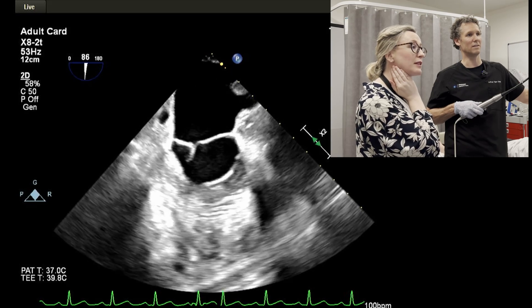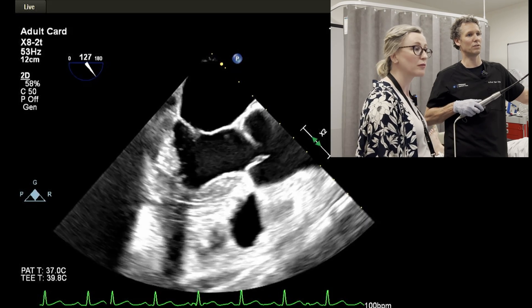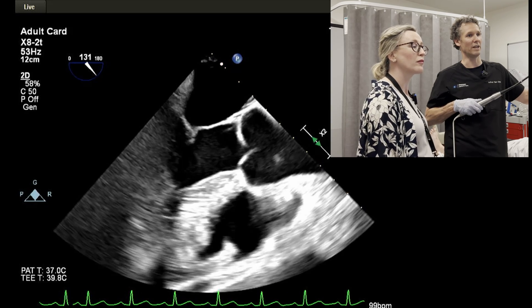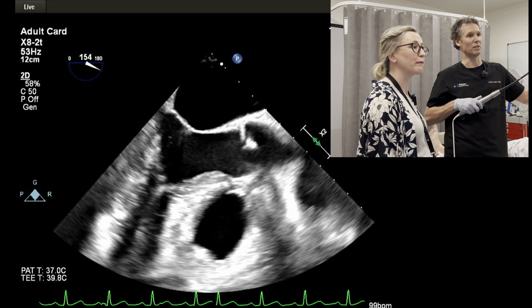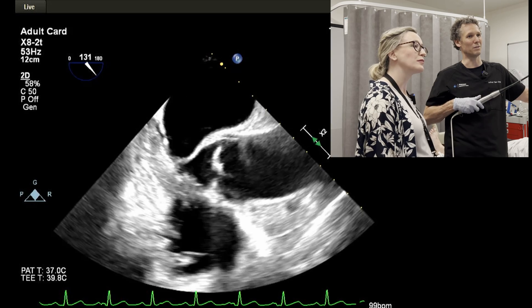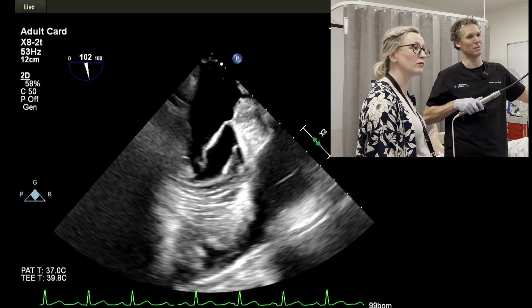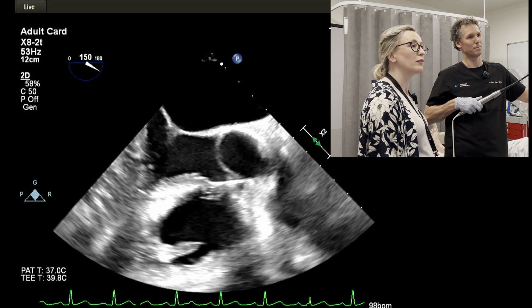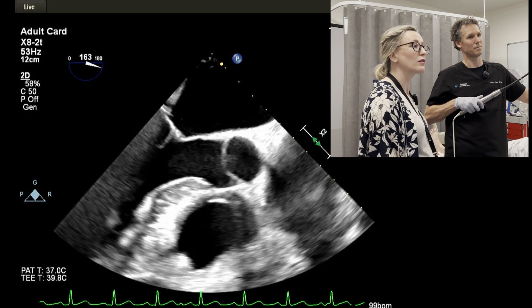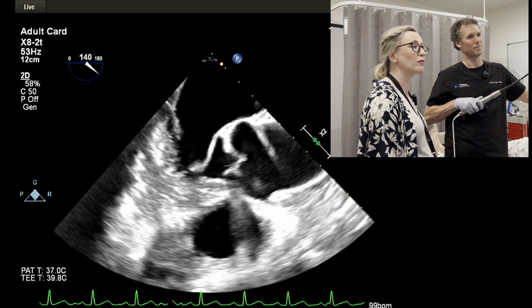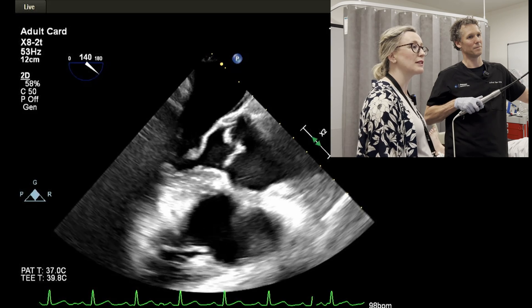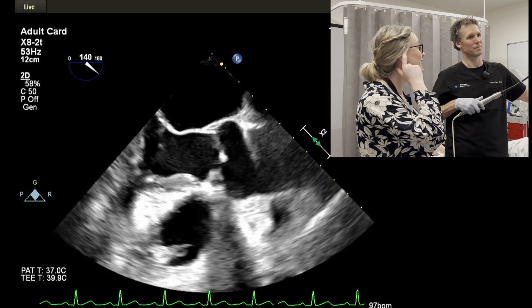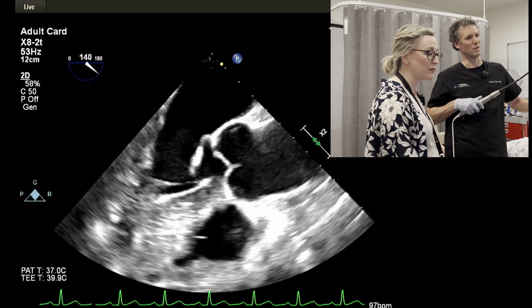Long axis is going to be around 120 degrees. I try and find the aortic valve in there, then change the angle a little bit, trying to open up both the left ventricle and the aortic valve — it's a little tricky with this patient. We can obviously see different cusps, which is slightly different to what we're used to seeing on transthoracic. That's probably the best long axis view I can get.